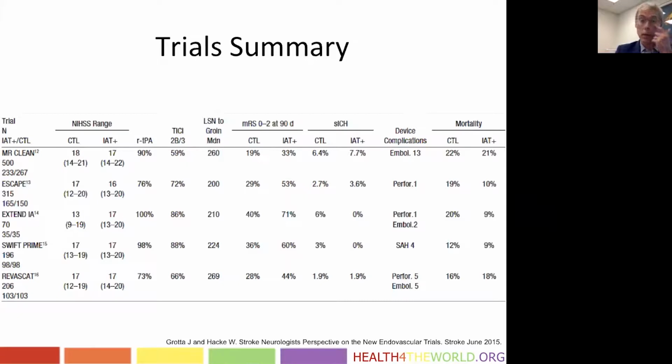I'm not going to go into too much detail about that, but suffice to say what we're calling these are large vessel occlusions. So most of these patients got IV TPA of some sort. All of these patients got a non-contrast CT. All of these patients received some sort of CT angiogram to make the determination as to where the actual clot was. A subset of these patients received physiologic imaging, i.e. collateral scoring or CT perfusion or some additional imaging component that allowed them to make assessments as to the function of the brain beyond just where the occlusion was and what the core infarct was based off of non-contrast CT.